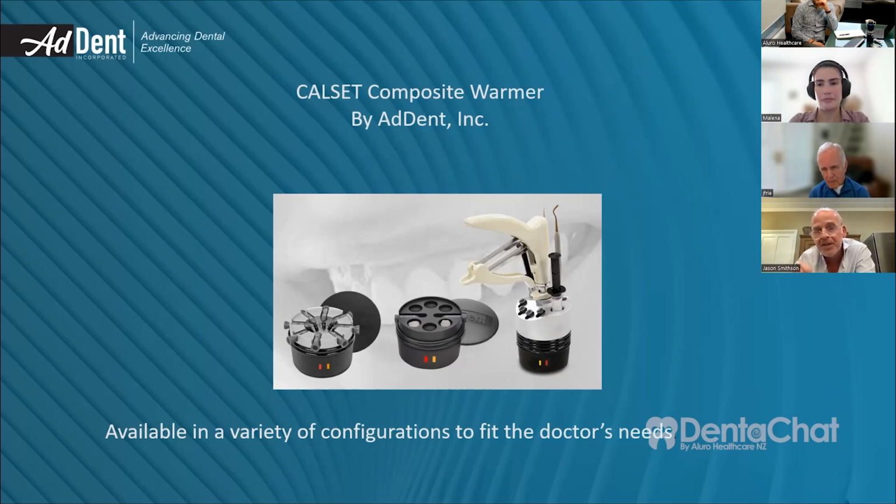Now, the composite is actually insulated by the plastic of the compule, which is also heated. So it's losing heat at a much slower rate than if you just scooped it straight off the flat. The other cool thing, which Josh didn't mention in his final question, and which is one of the unique things about the Calset, which I like, is the fact you can heat the instruments. So, very unusually, you're sculpting the composite resin with a heated instrument.